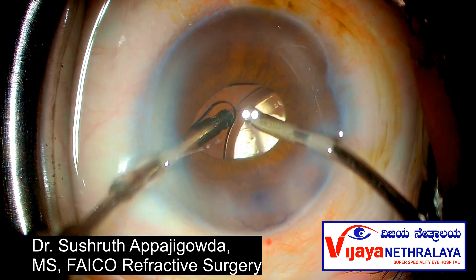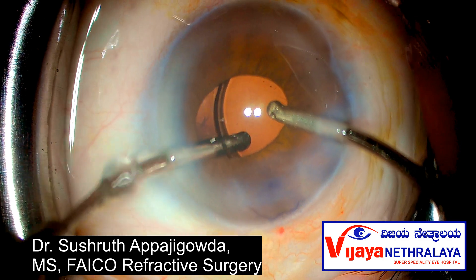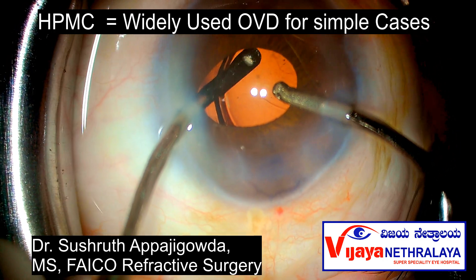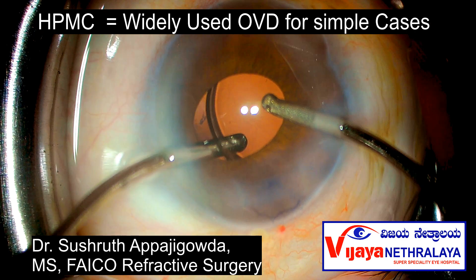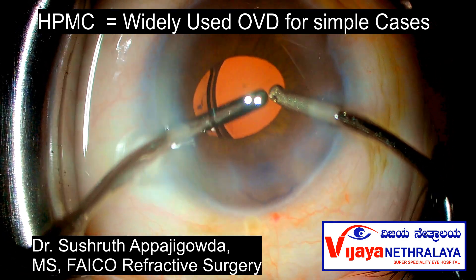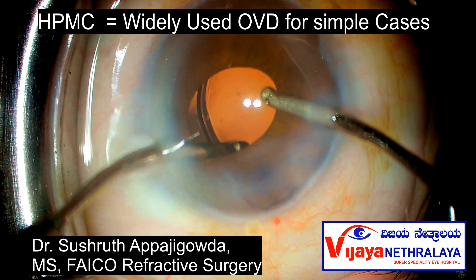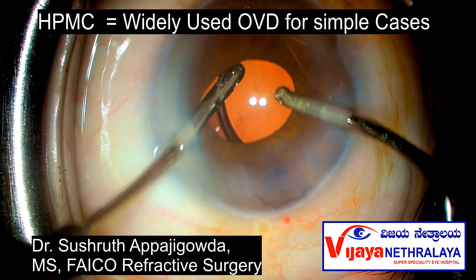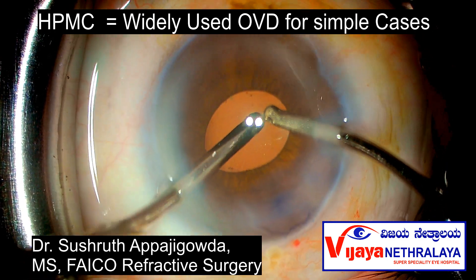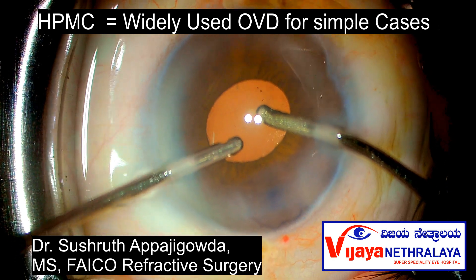Here I am going behind the IOL and removing all the OVD. In India we extensively use HPMC, which is hydroxypropylmethylcellulose. HPMC in my opinion has been a game changer as it is very easy to mass produce. It is a very dispersive OVD and has made cataract surgery more affordable for both surgeons and patients alike.